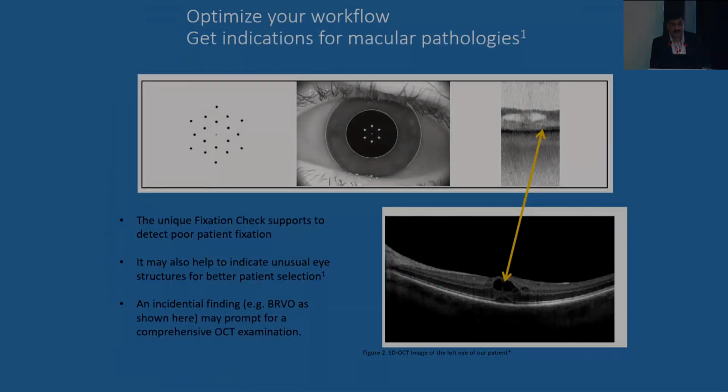The other advantage nowadays is that with most of these scans, you can see the foveal pit also, or pick up an old case of BRVO, and immediately refer them to your retina colleagues. Make sure that you are ready, so you will give the best perfect outcome.